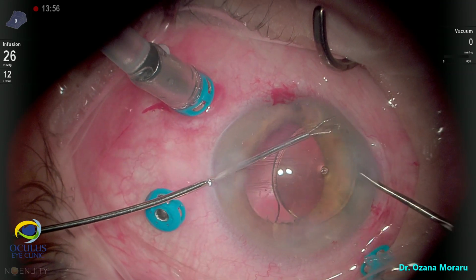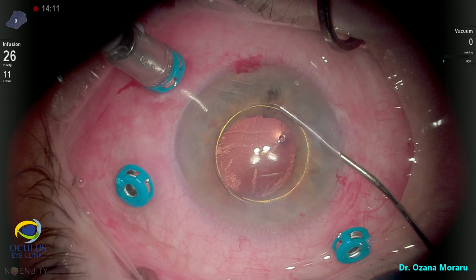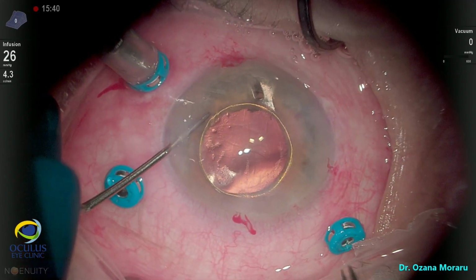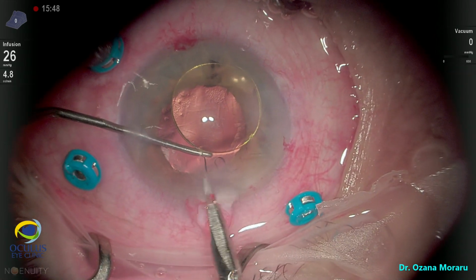At this point, we inject OVD again, which is much more helpful than before, because previously we injected OVD, but it all fell into the posterior segment. Now it is really very helpful, Viscoat especially, which protects the cornea during our maneuvers to remove the IOL.